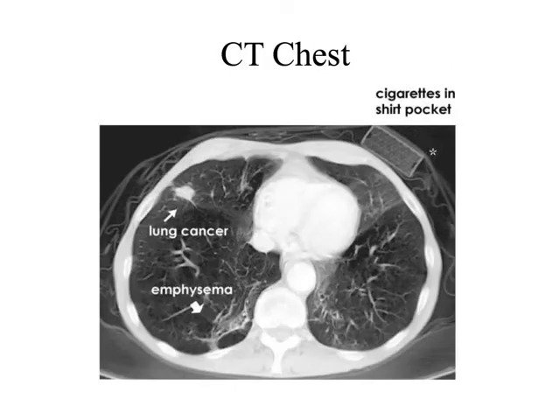So here's a CT chest, routine chest study, showing lung cancer, emphysema, and some cigarettes in the patient's shirt pocket. Let's move along to the heart.